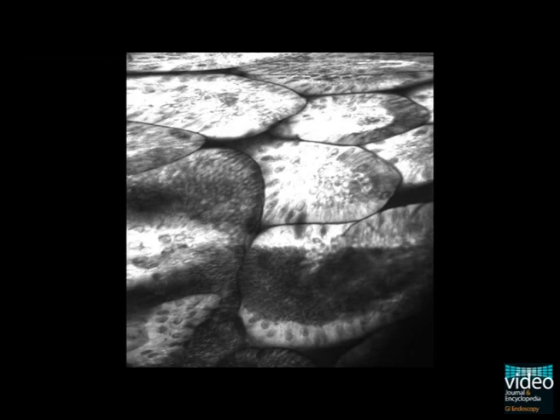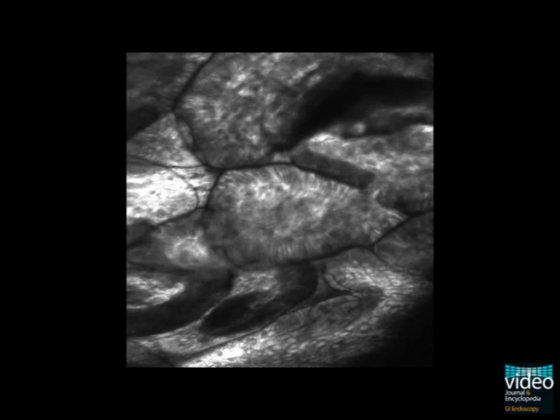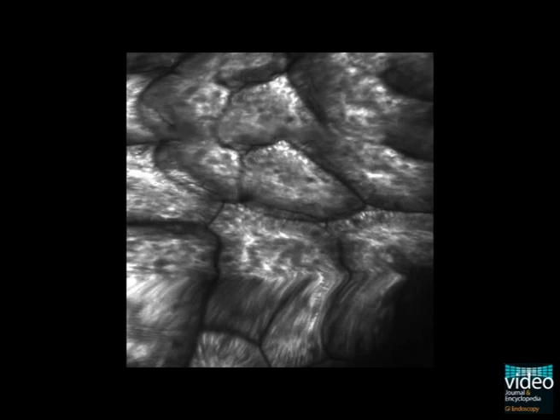Black spots within the epithelial cells correspond to mucin. This allows the easy identification of goblet cells, a typical feature of intestinal metaplasia.